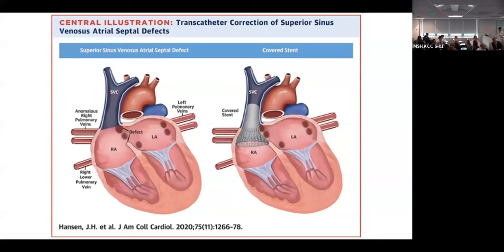It's an architectural, if you want, problem. And if you can devise something, think about it as an aneurysm. You have to seal up top and below, and in the middle, they hopefully allow some flow still. So this is a mandate, and how well a device can allow that. That's essentially all it needs.